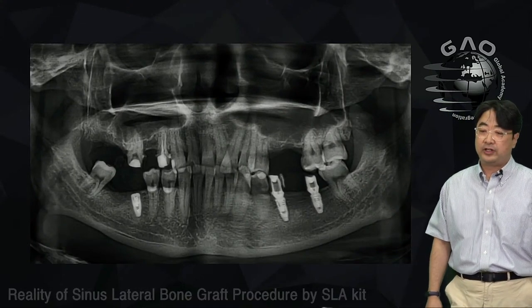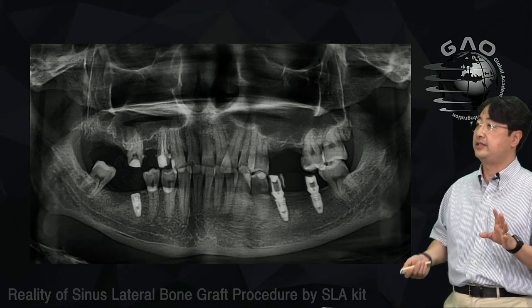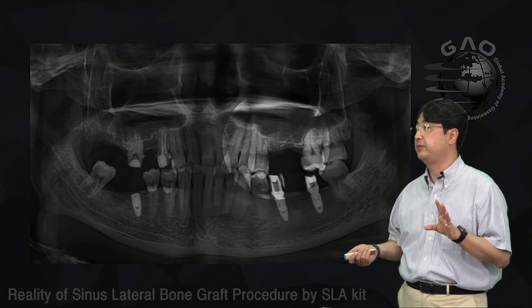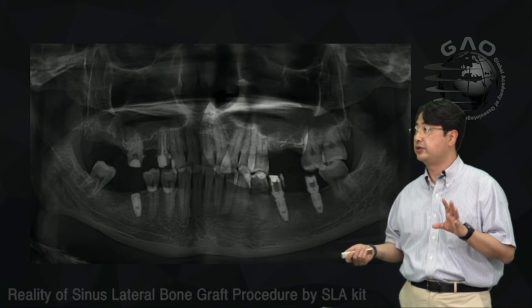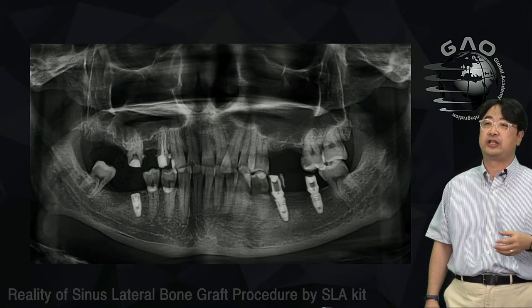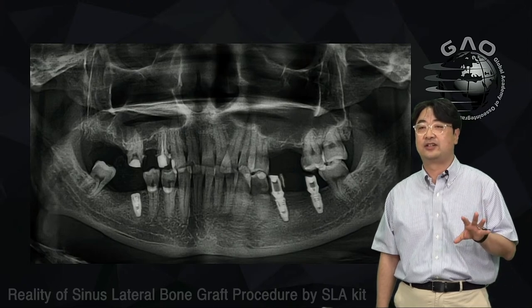From now on, I'm going to show you a real clinical case of one of my patients. He needs a dental implant on the left posterior. As you see here, there is not much bone for the implant placement, so definitely we're going to do some bone graft, a lateral sinus bone graft.